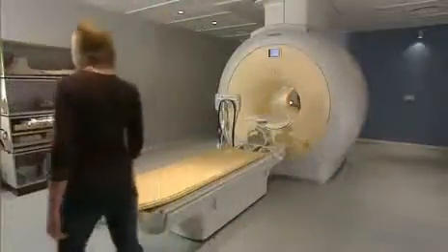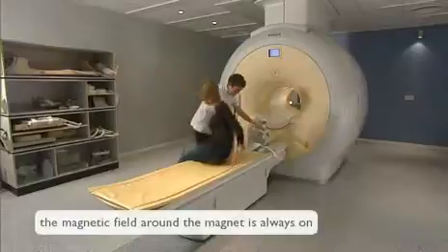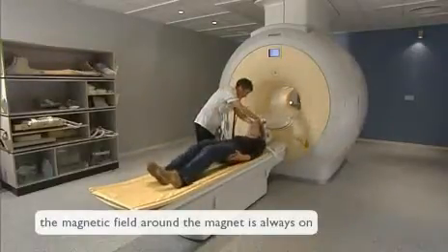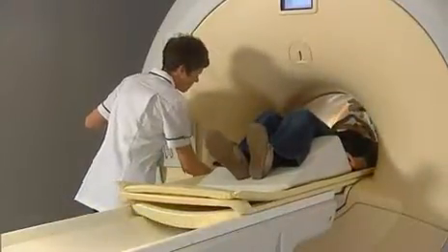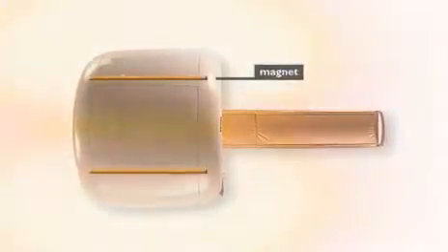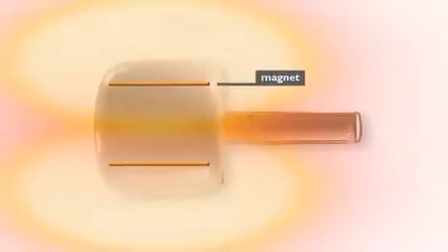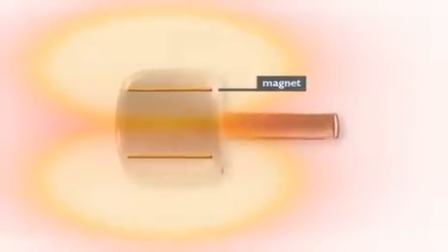Although it cannot be seen or felt directly, the magnetic field of an MR system with a superconducting magnet is always on and must always be treated with respect. The main magnetic field generated by the magnet is not completely contained within the bore of the magnet. In fact, the magnetic field goes right to the edge of the room.